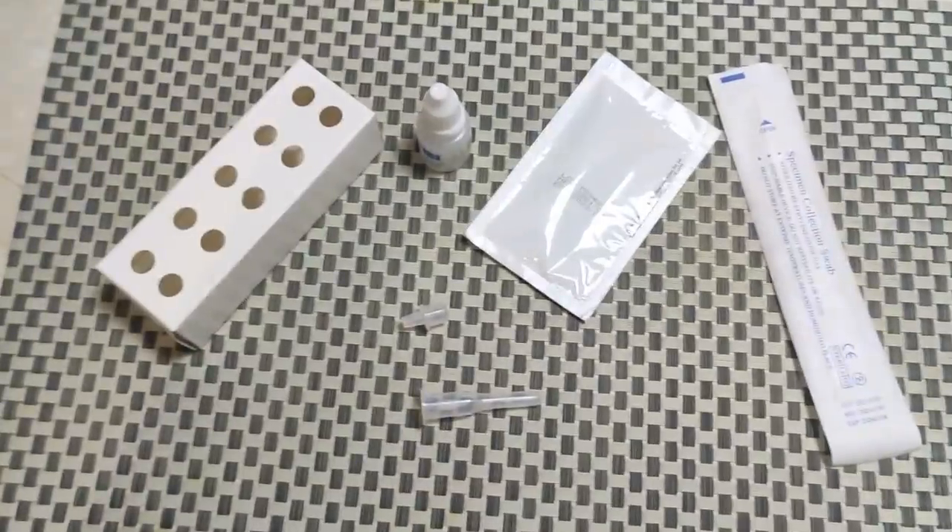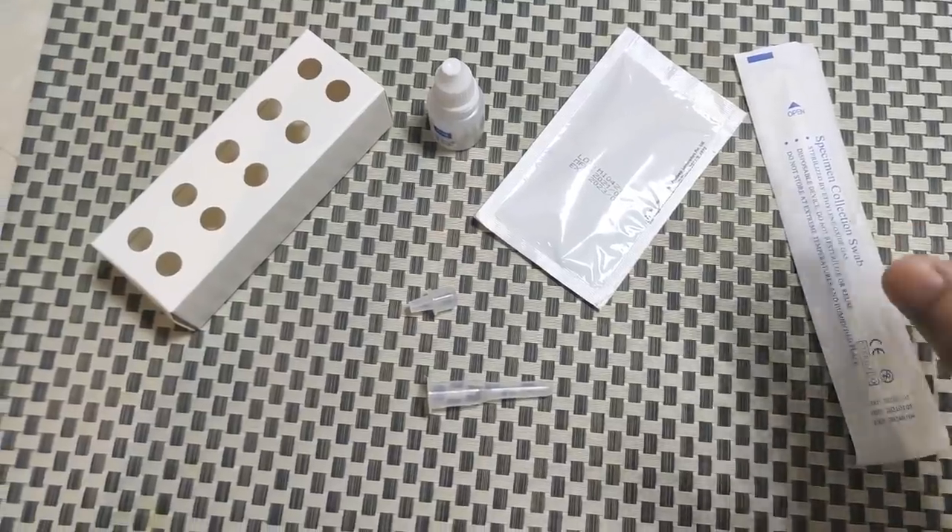This is one particular test strip and I am going to show you what is inside. I recently got the box and I am going to show you what is inside and also how to test it yourself. Follow the steps and I will also show you the results. Here we have everything that is needed for one sample testing.